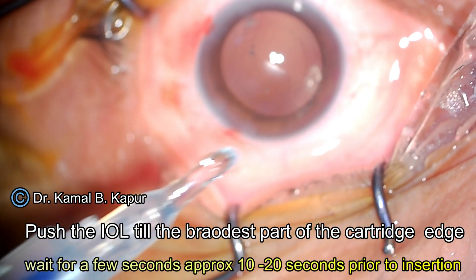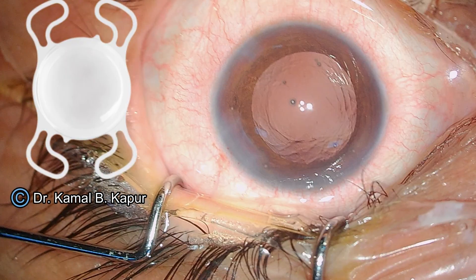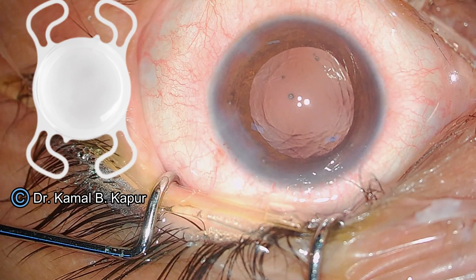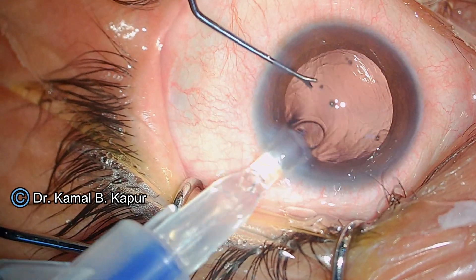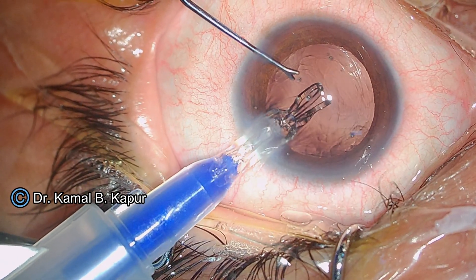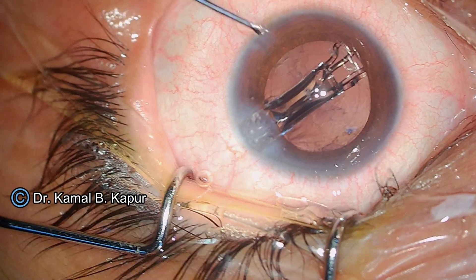We slowly close the flange until we hear a snap, wait for a few seconds, and then start pushing the lens until it reaches the broadest part of the cartridge system. You will see a small nub on the right leading side and a small nub on the left trailing side. Since this lens comes in a 2.2 millimeter injector cartridge, you can push it through a 2.2 millimeter incision, though we are using a 2.8 millimeter incision here.